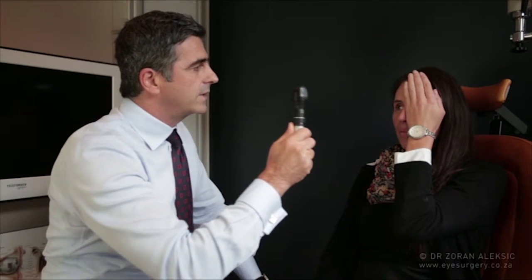If the patient can't see hand movements, the next step is to determine if they can see light at all — and that's very important. You can use any source of light: an ophthalmoscope, a torch, or anything similar, and ask them if they can see light. If they say no and the light is bright, that is marked as no light perception.